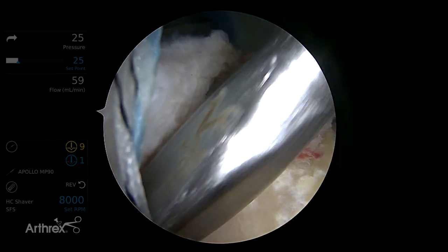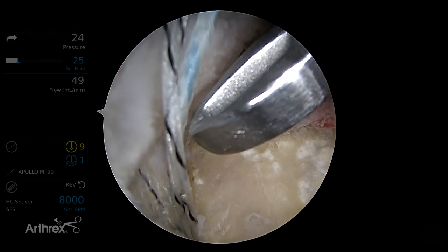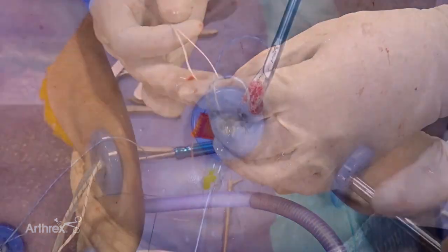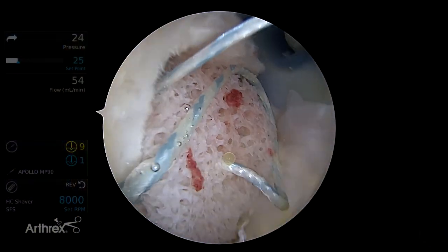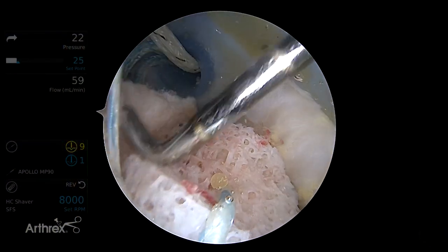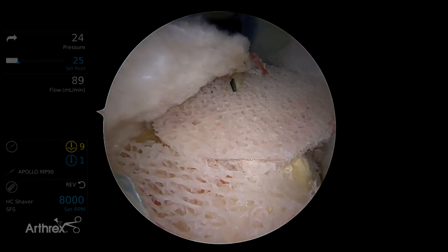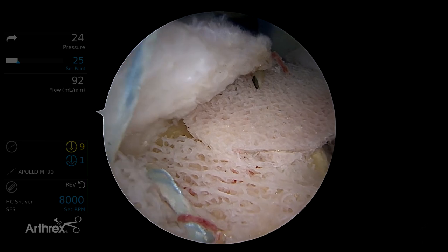We're going to come in through the lateral portal and bring out the repair suture and the looped end of the shuttle suture to repeat the process for our second bio button. We fold it — this fixation does not have to be tight; this isn't for mechanical purposes, it's just to get our sponge for coverage of our footprint. You can really see the open pores of the graft and how that's going to help healing of the cuff back to bone.